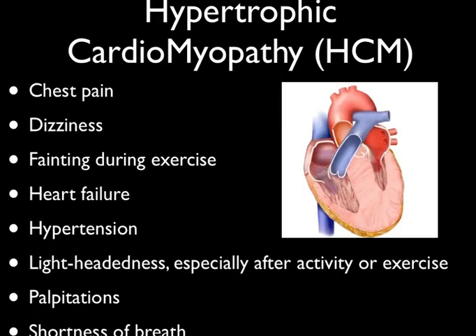So now that you know what the parasternal long axis looks like, you can get an idea of where the septum of the heart is. And you can see here with this patient who's got septal wall, or asymmetrical septal wall thickening right here. In other words, it's the septum that's thick and the other walls look okay. This is what's known as hypertrophic cardiomyopathy. And you saw that little catheter go in there, and they can treat that by injecting ethanol right into the septum to help shrink it.